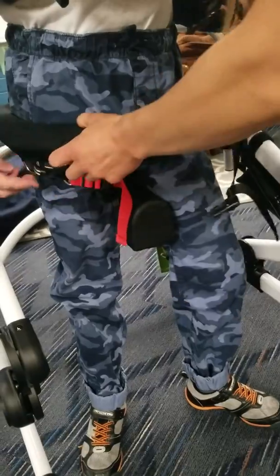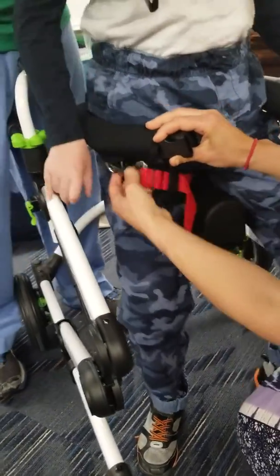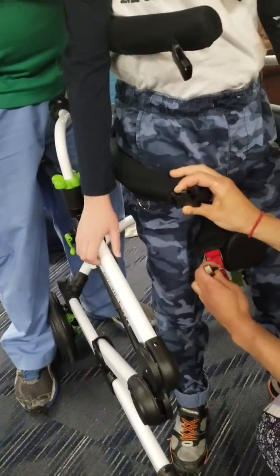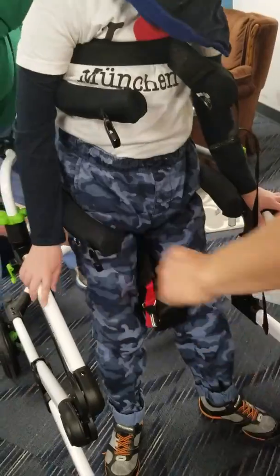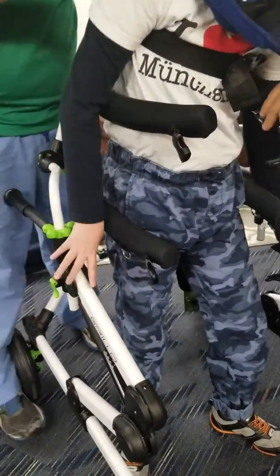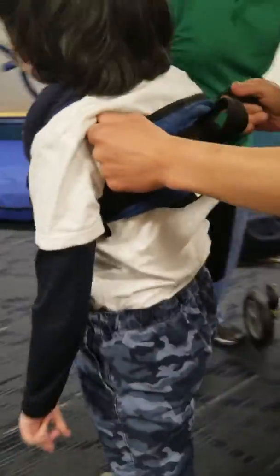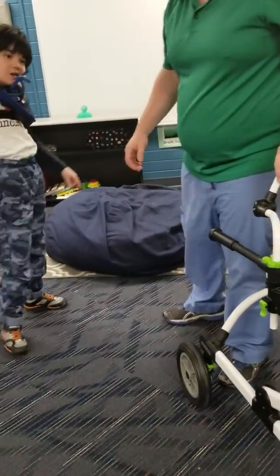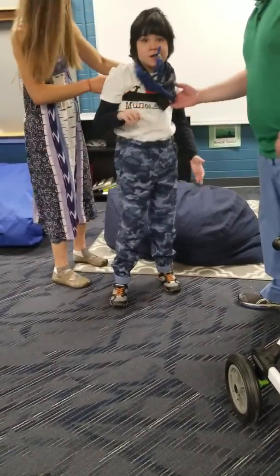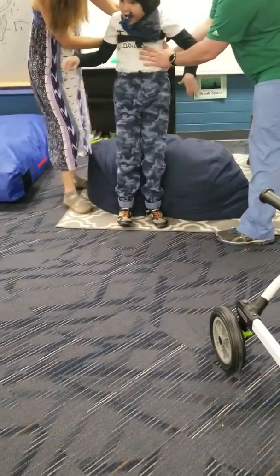Buckle. And so just do the same thing. And you were right. This is that green one that popped off. It makes perfect sense, especially with the clip facing out, which is better for Ruffin's leg, but it was the pommel. Okay, perfect. And then what we'll do is we can hold up, and then we can just move this. Oh, Ruffin, you superstar. Great. I think the hardest part is just maneuvering brakes, lock, brakes. Ready? Sometimes with one person it can be a little trickier.